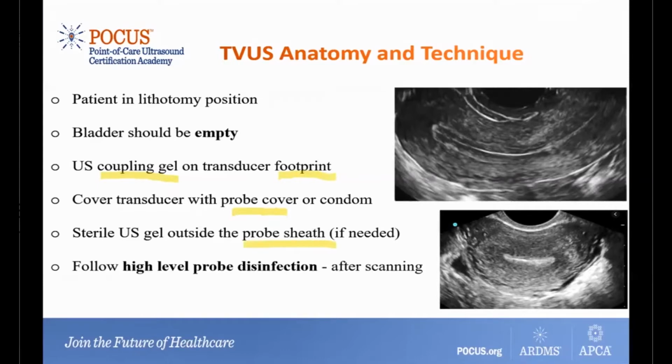After the procedure, you definitely want to perform a high-level probe disinfection procedure to make sure there is no cross-infection from patient to patient. Even though the probe sheath looked intact, we still definitely want to do that, and also contact the ultrasound manufacturer who provided the transducer so they can provide you the recommended technique, chemicals and methods for performing that level of disinfection.